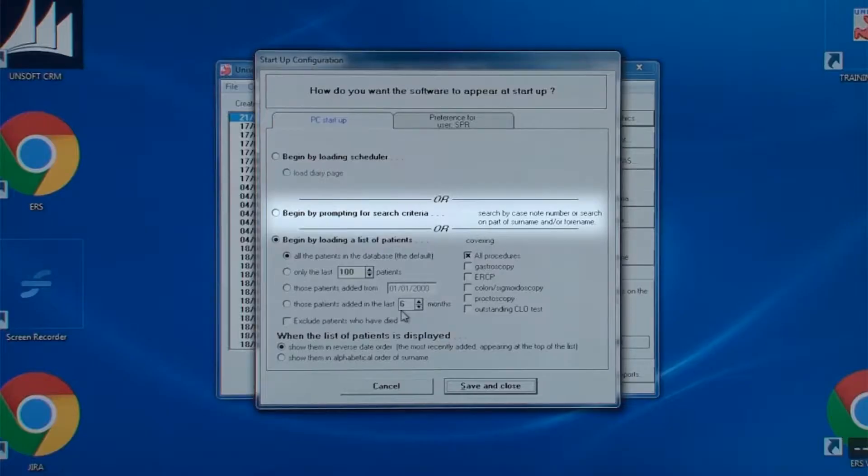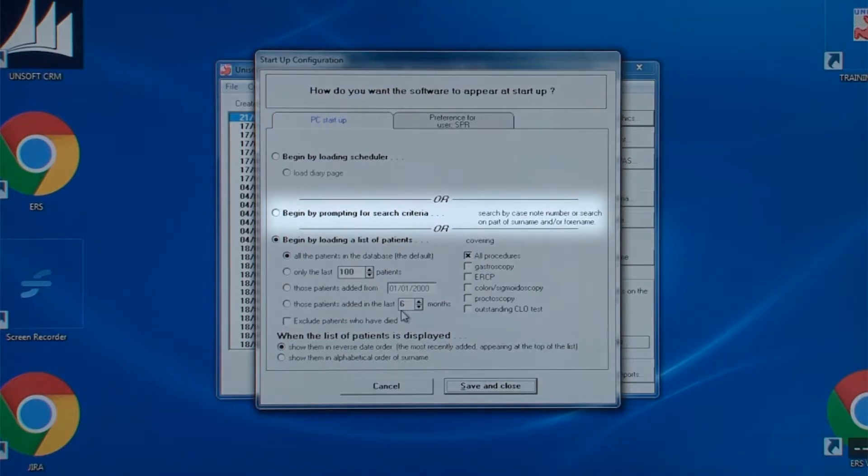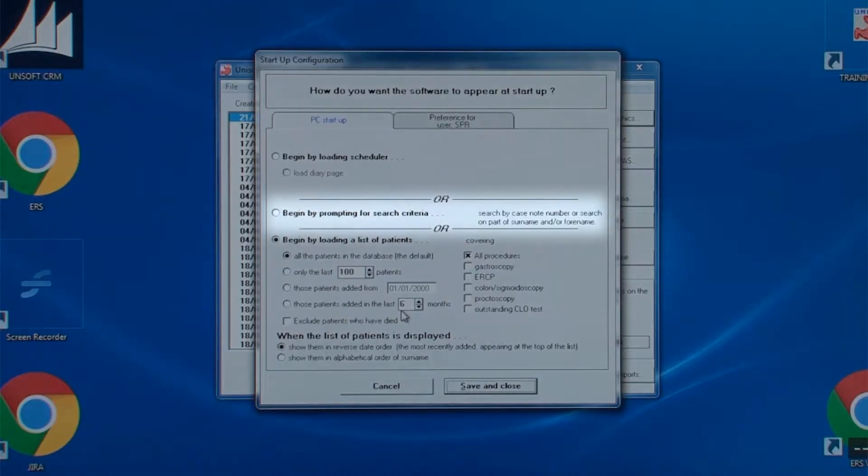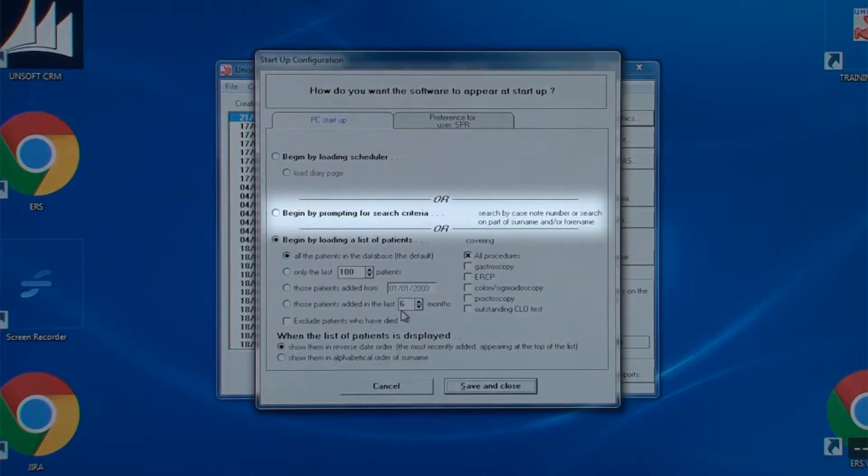However it is more popular to have the screen displaying search criteria. This prompts the user to enter either a case note number, a medical record number or surname and should be used in the endoscopy rooms as this reduces the risk of selecting the wrong patient.